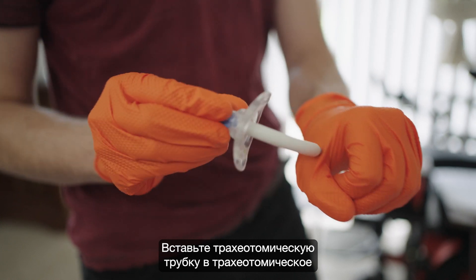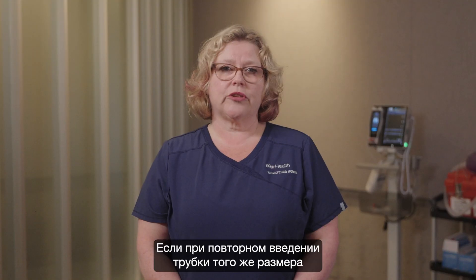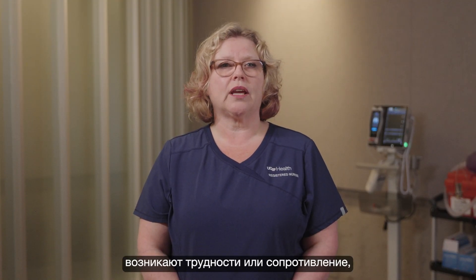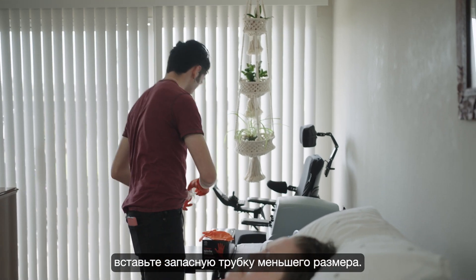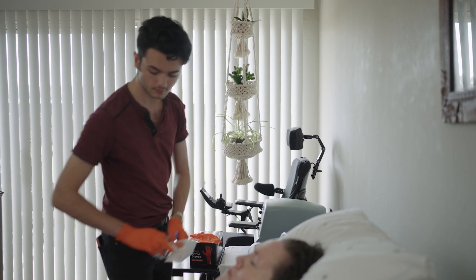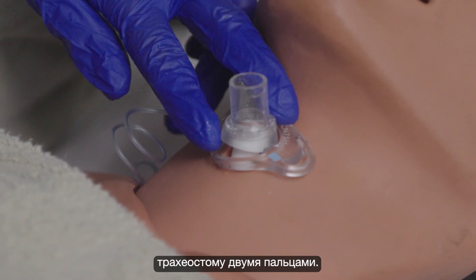Guide the trach tube into the tracheal stoma 90 degrees and rotate downwards. If there is resistance or difficulty reinserting the same size trach, do not attempt to force it in. If you have determined difficulty with the same size trach, insert the spare smaller sized one. Once the trach tube is inserted, remove the obturator immediately, keeping two fingers on the face plate.